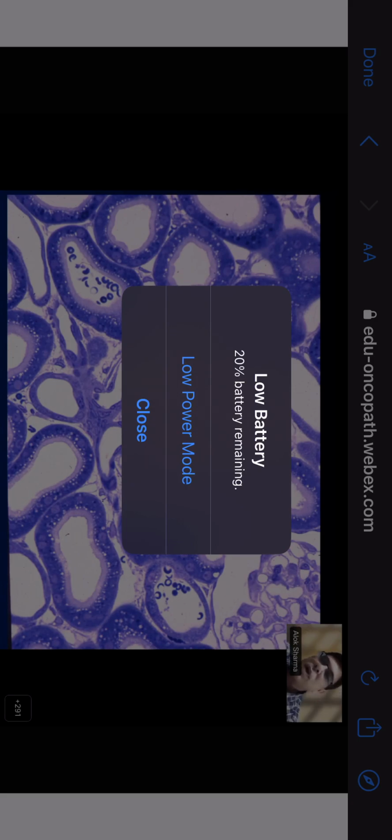So this particular area which is highlighted here is a glomerular capillary, right? So it's a small thread-like structure within a glomerulus. It's a single capillary. The normal diameter of a glomerulus, if you look at it under light microscope, is somewhere around 250 microns. So if you take a glomerulus at equatorial section, it would be around 250 to 300 microns in an adult patient. Children, of course, it is much smaller, but what I'm talking about is an adult patient, right? So this is one glomerular capillary of that particular normal appearing glomerulus.